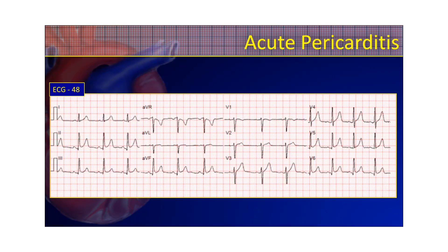Here's one with a little bit more significant ST elevation. On this one, that Spodick's sign is even more pronounced and more obvious — you can see it in almost every one of these leads that has ST elevation. Again, it's concave upright ST elevation, going across leads that are reciprocal to each other. The patient is the big indicator. Is this patient's pain positional? Are they febrile? Because it's an inflammation, it's an infection — it could be causing them to be septic. Do a good assessment of your patient and identify this acute pericarditis.